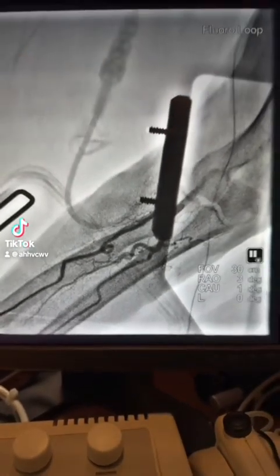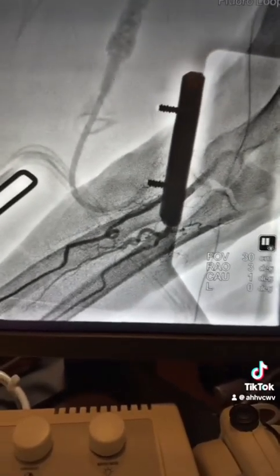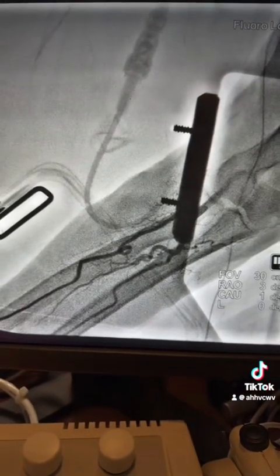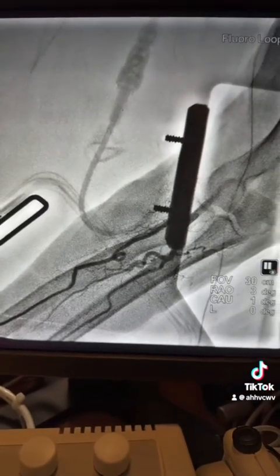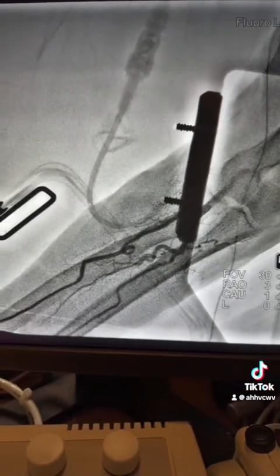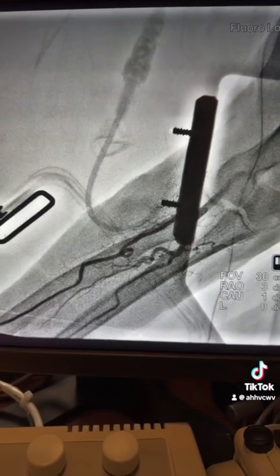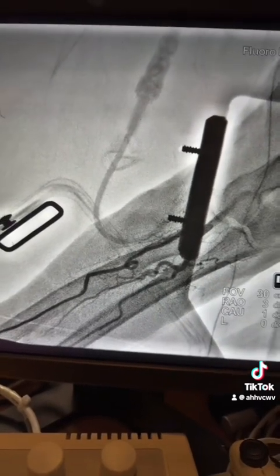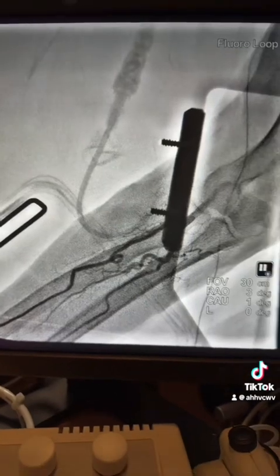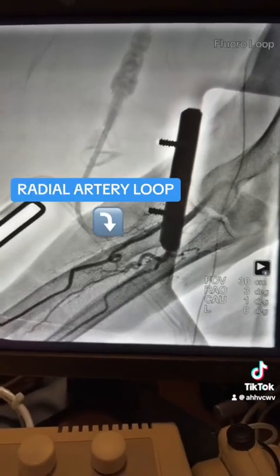Hello, the second case of today — a shockwave case. Radial access, 80-85 year old lady with acute coronary syndrome. Starting with the radial access, as you can see here, there is a loop.